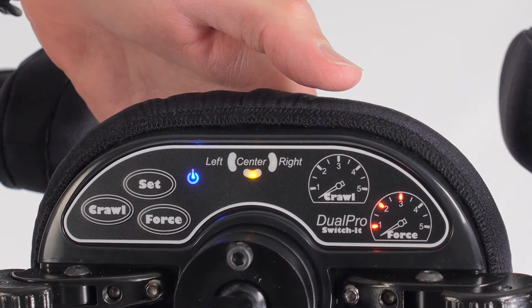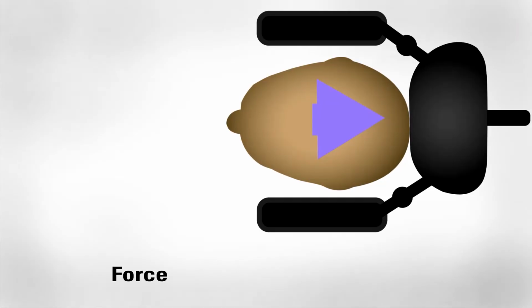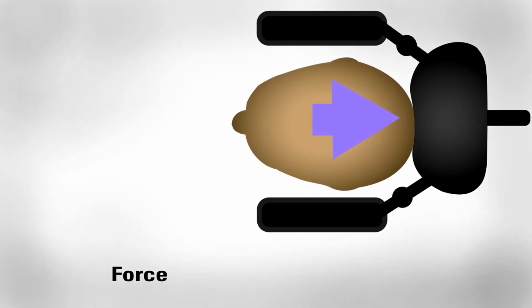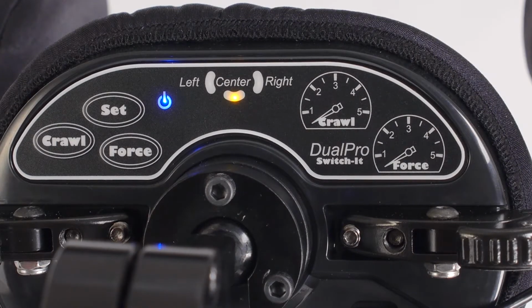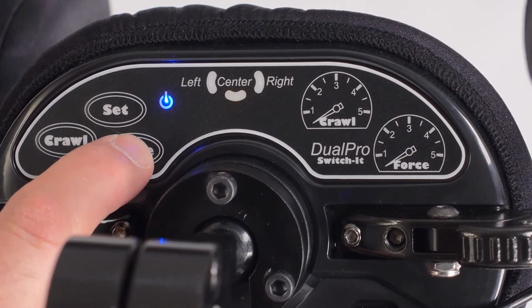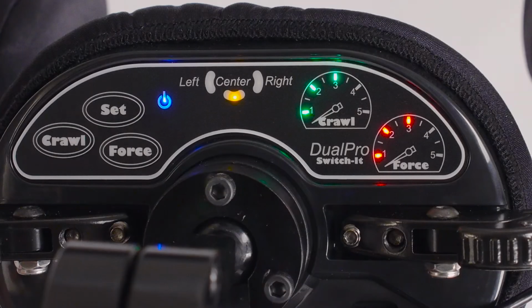Force is a measure of the user's head force against the sensor pad. As the force against the pad increases, the chair's speed increases. If there are no lights in the force indicator, the force sensors are turned off. Each red indicator light equals the amount of force required to reach full speed. This is different than the proximity or crawl lights, which represent a percentage of total speed.